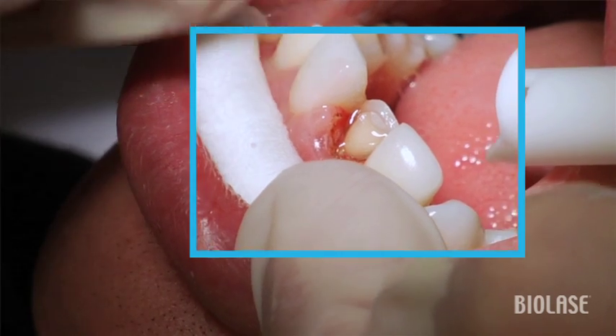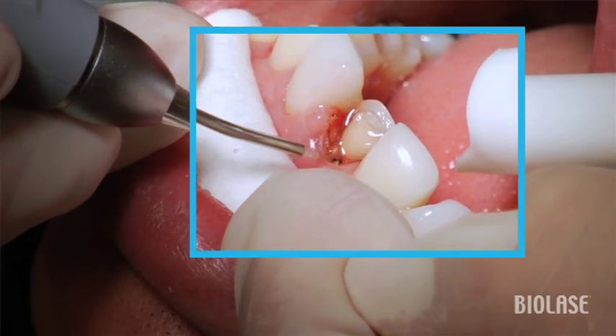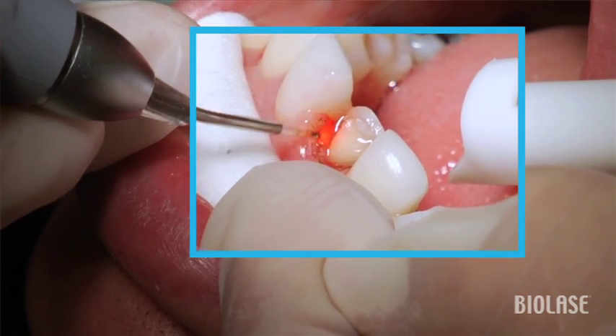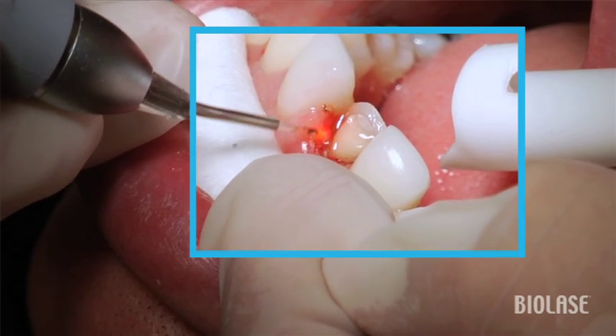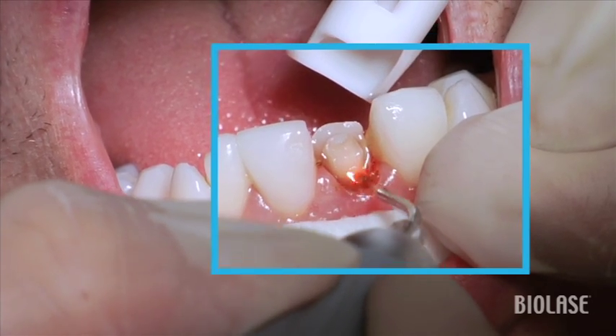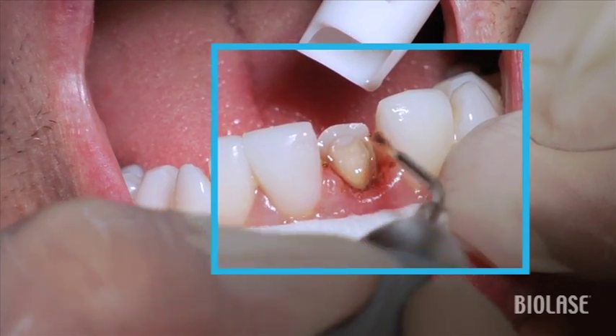Notice too that if possible, if you can move the lip out of the way, it works a lot nicer if you can keep the contour or the angle of the tip more normal rather than creating a reverse architecture inside the tissue. Try to keep it at either 90 degrees or maybe something like 120 degrees in order to remove tissue.